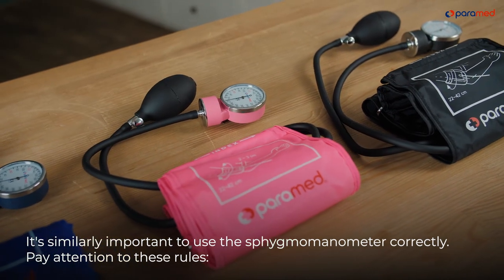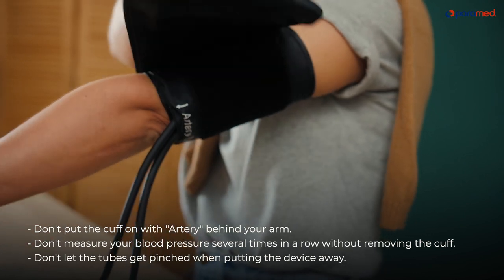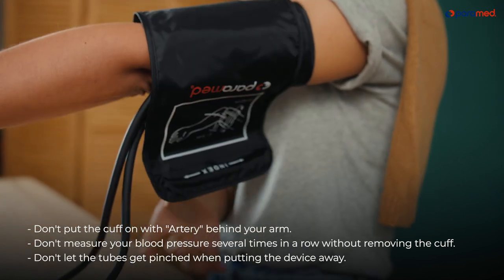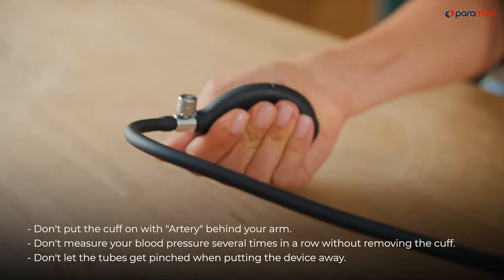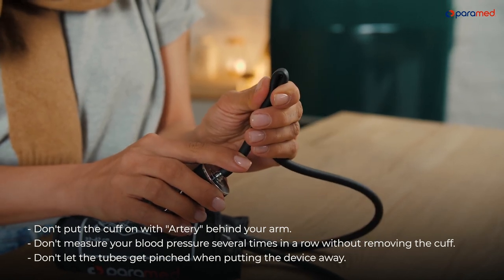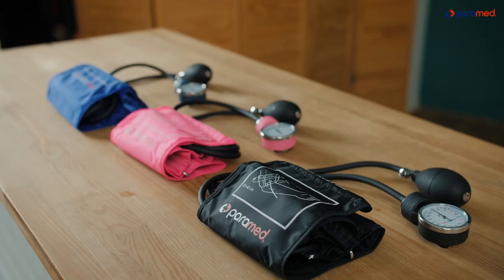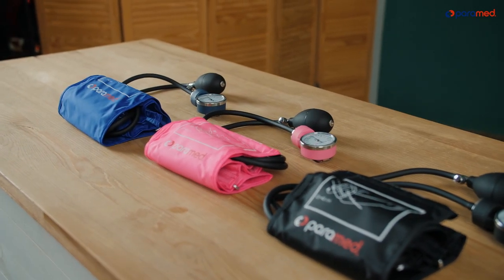It's similarly important to use the sphygmomanometer correctly. Pay attention to these rules: don't put the cuff on with the artery behind your arm; don't measure your blood pressure several times in a row without removing the cuff; and don't let the tubes get pinched when putting the device away. Paramed will be your reliable assistant for blood pressure measurements. Use it comfortably. Be healthy and stay safe.